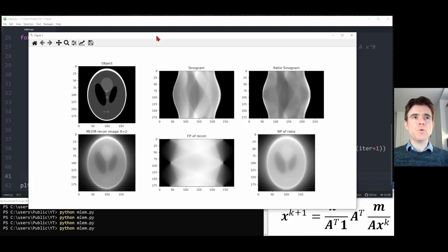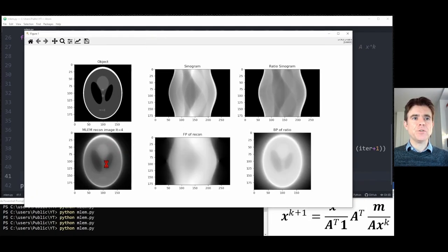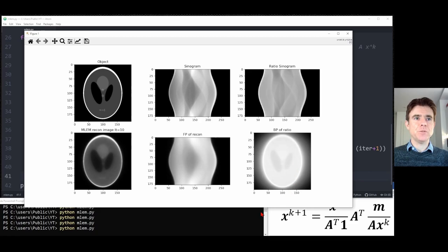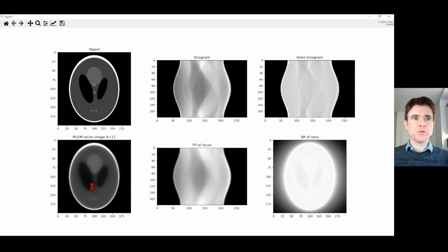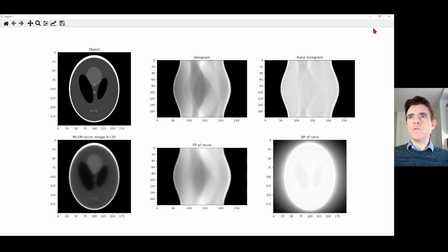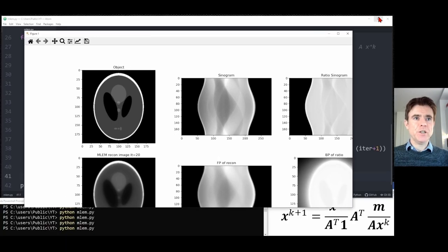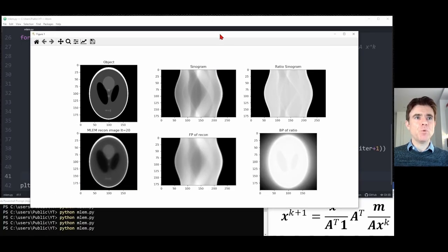Now we run the overall reconstruction. We can see the iterations unfolding: the reconstruction is forward projected, we get the ratio, back project the ratio, divide by the sensitivity image, and multiply. The bottom-left box clearly shows an improving reconstruction from the sinogram, ever more closely agreeing with the true object. That's how we implement the MLEM algorithm in standard Python, launched from a command terminal.